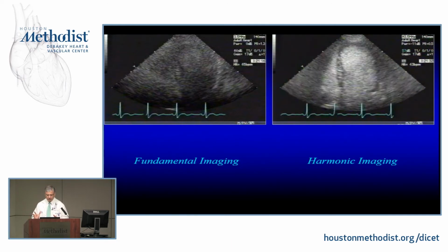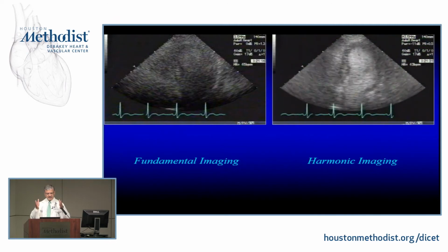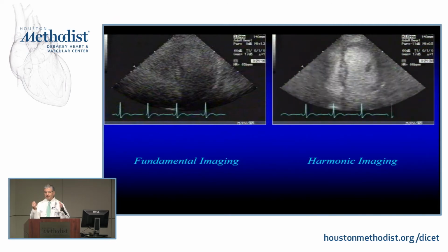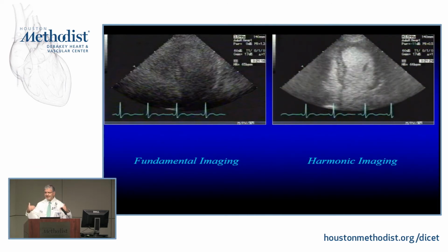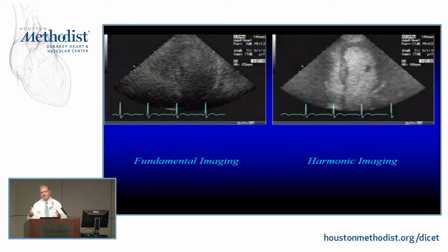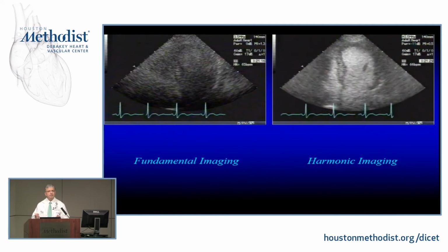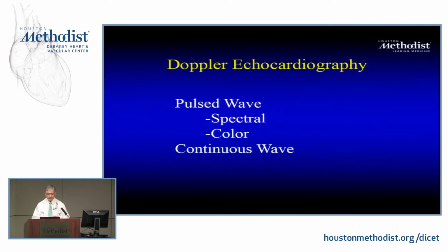So it helps you overall. But all I wanted to show you is that this is the same case, right and left. Just 1 second apart, when I flip on harmonic versus non-harmonic, the image is very much different. So understanding what goes on behind the scenes is important in almost any imaging. Ultrasound is even more crucial for that because there is a lot of knobology that you are doing. Yes, MRI and CT and all this will have their own knobology to do it.